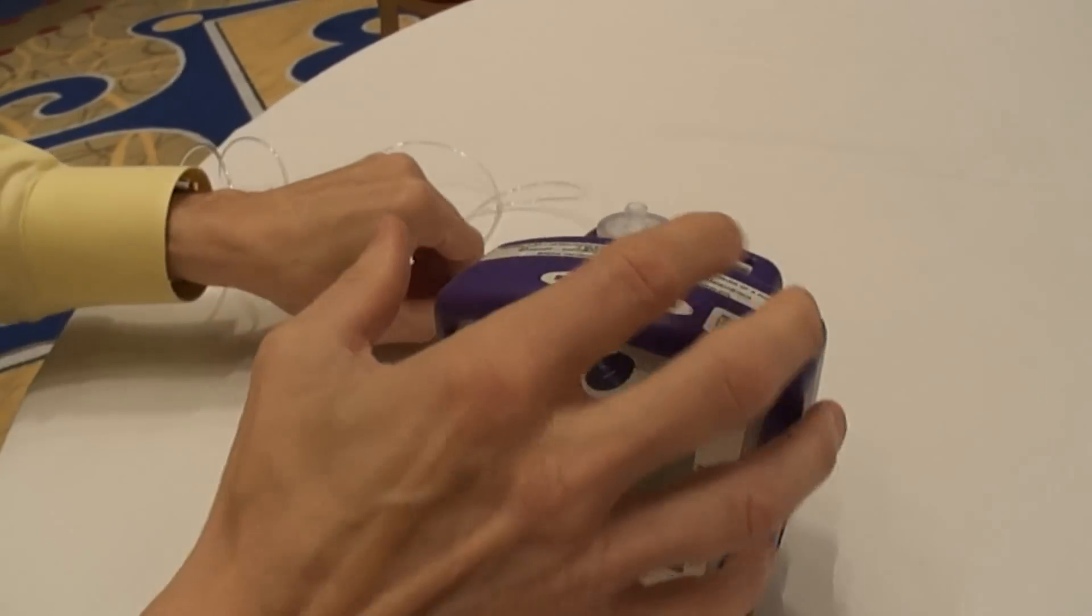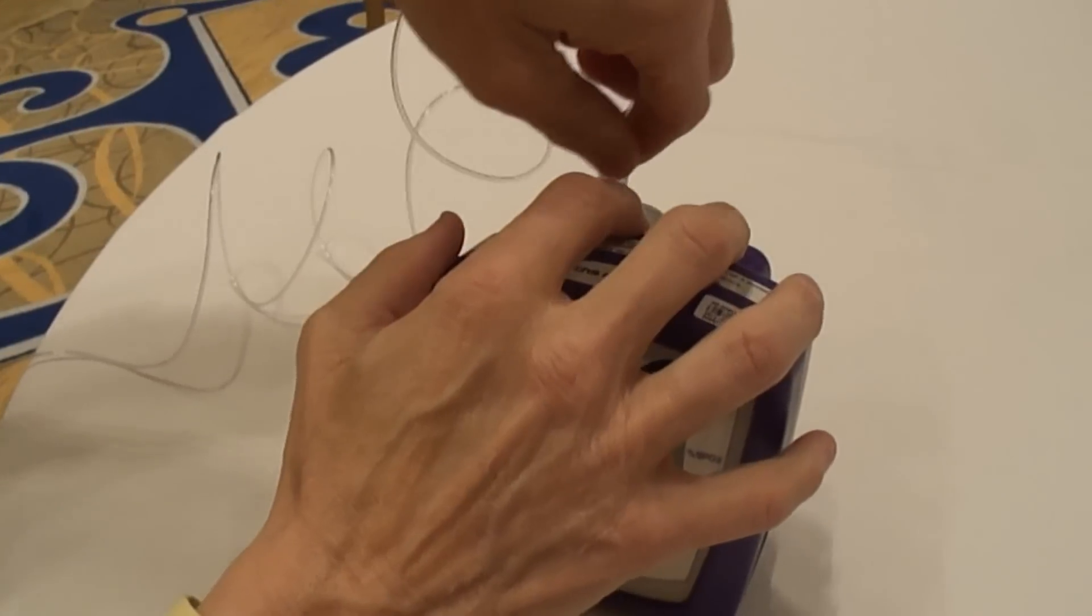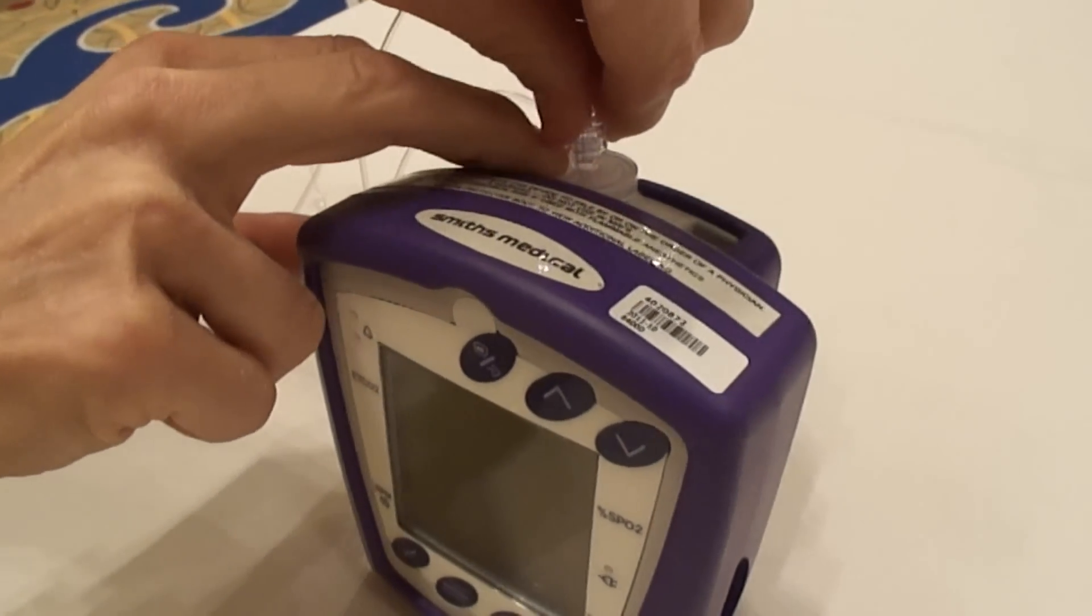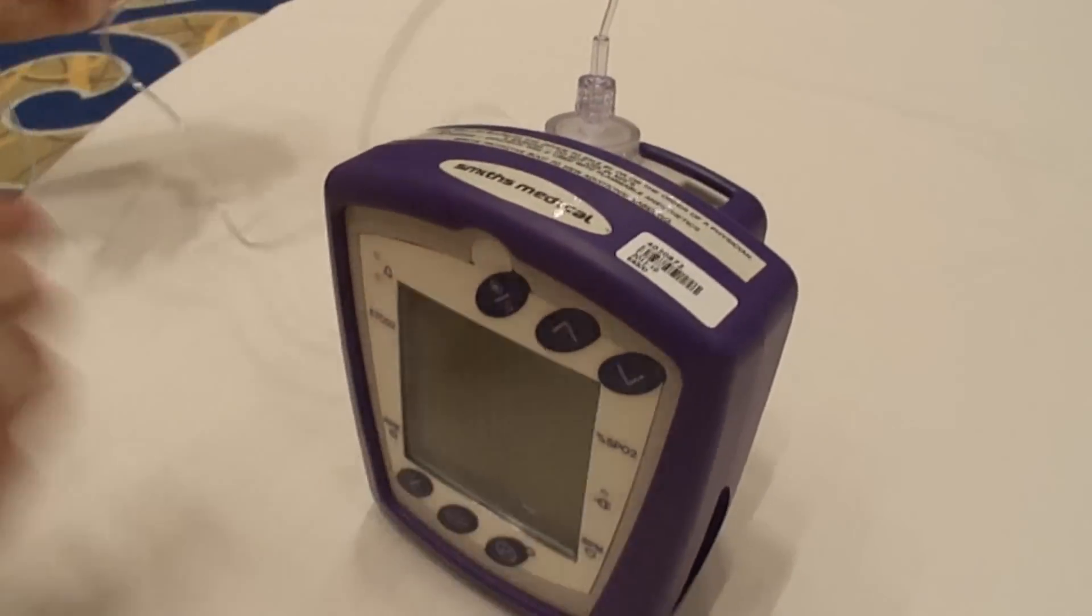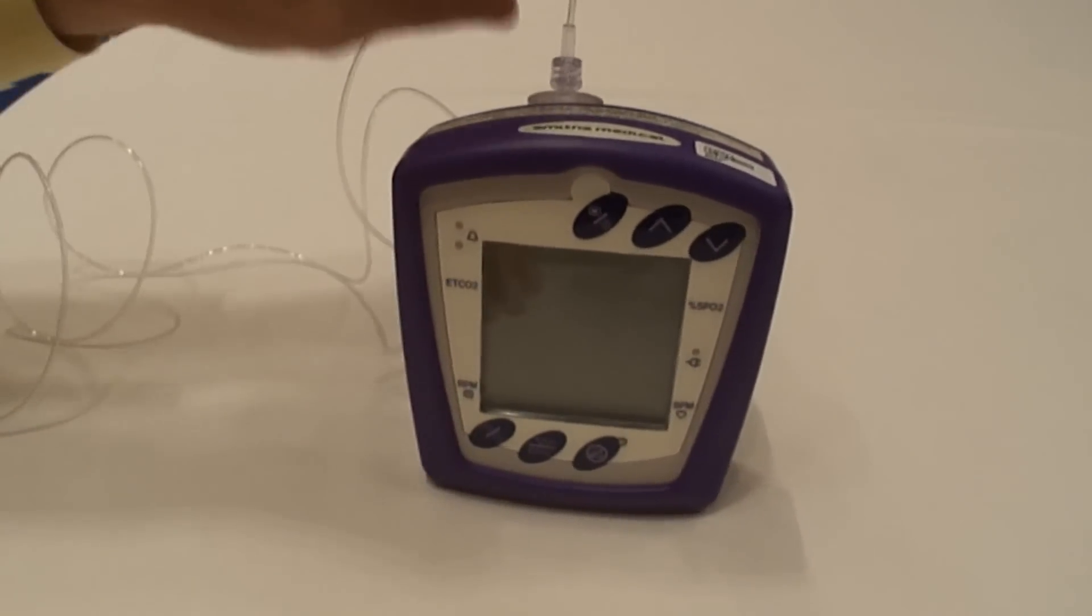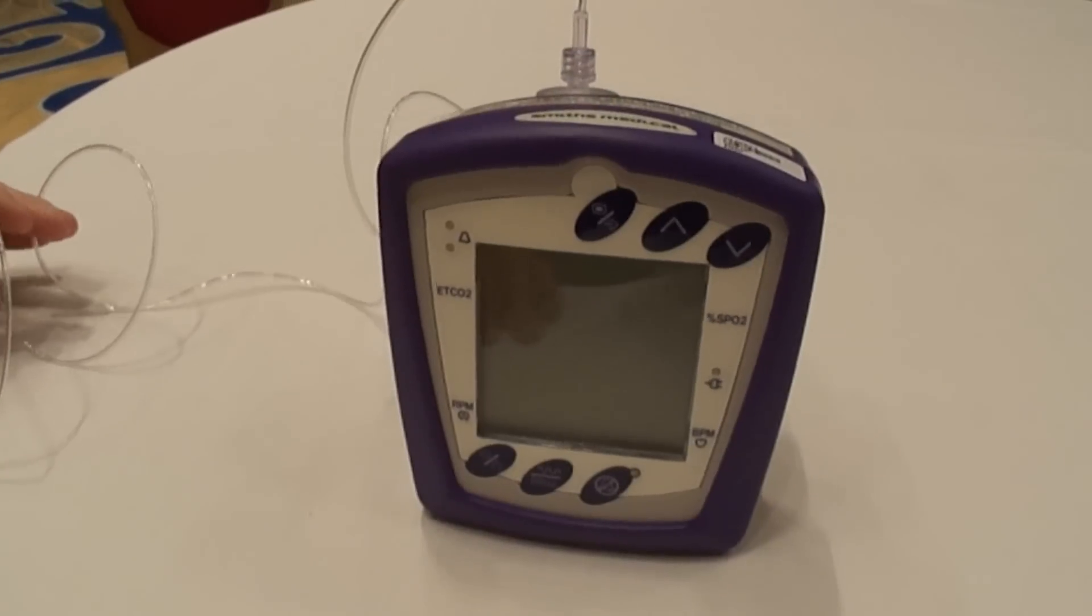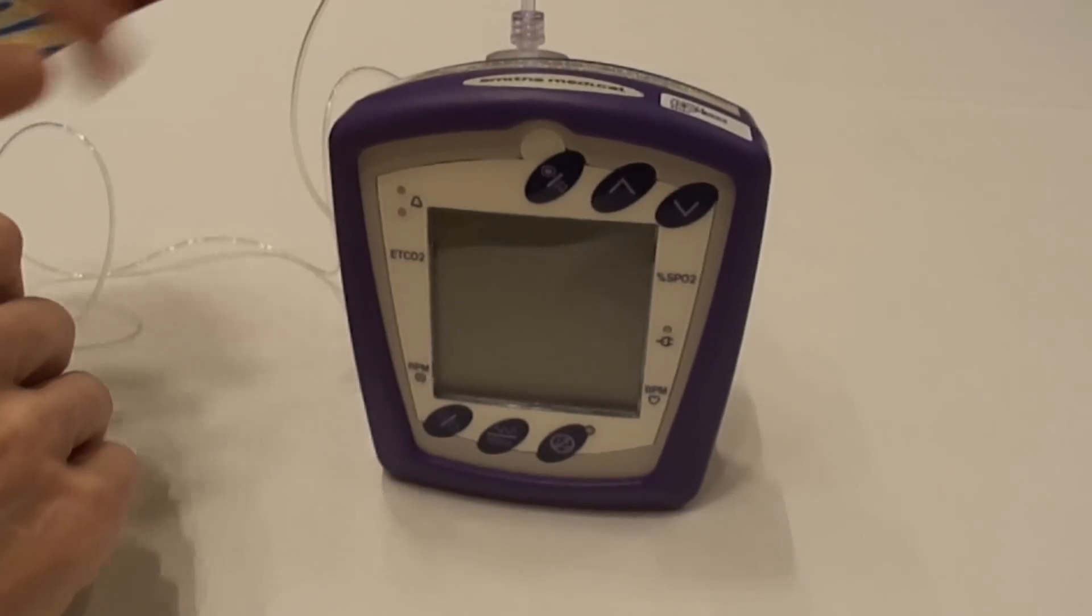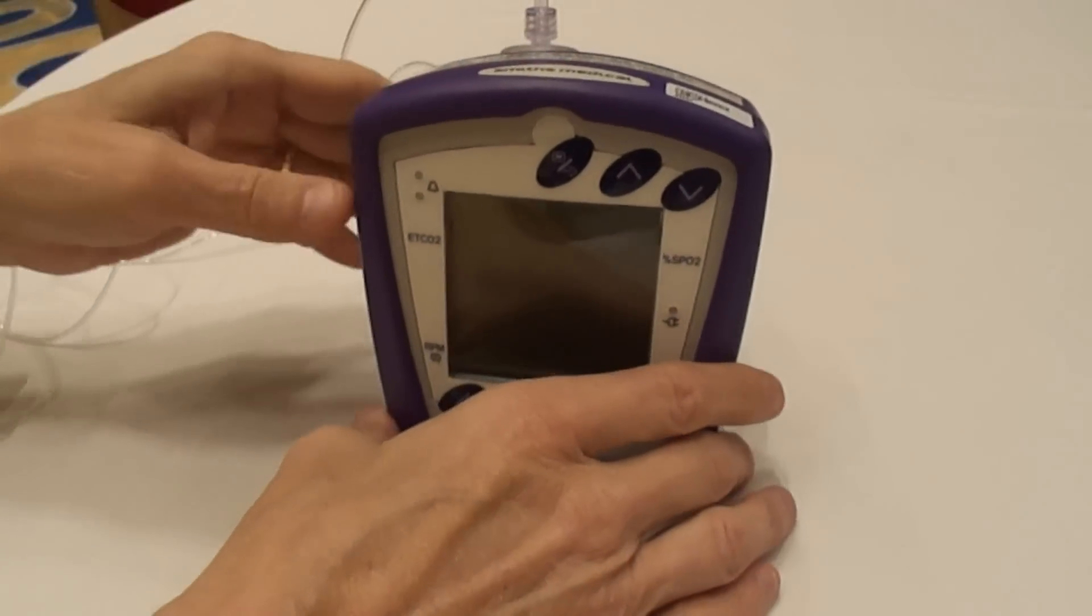Then you're going to have your end-tidal CO2 tubing, or nasal cannula, as we refer to it. Basically, it just locks right onto the back. You can use just the nasal cannula sampling line for CO2, or you can use a divided nasal cannula, which would allow you to administer oxygen and monitor the end-tidal CO2.